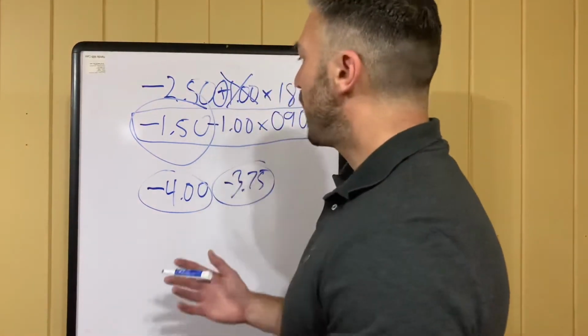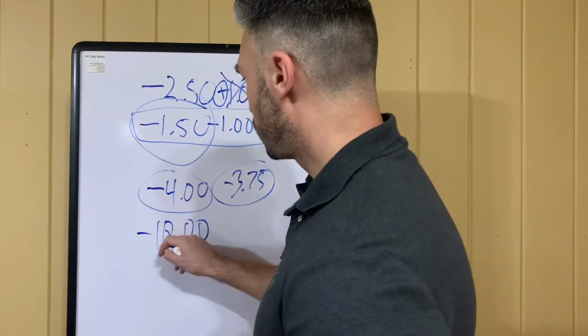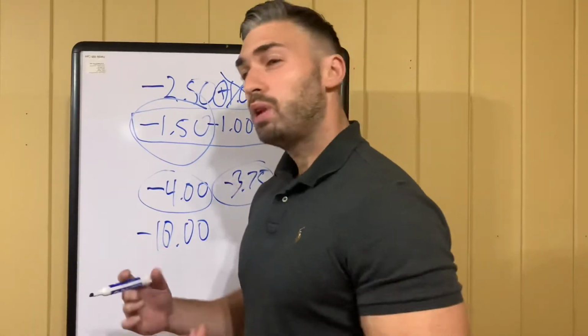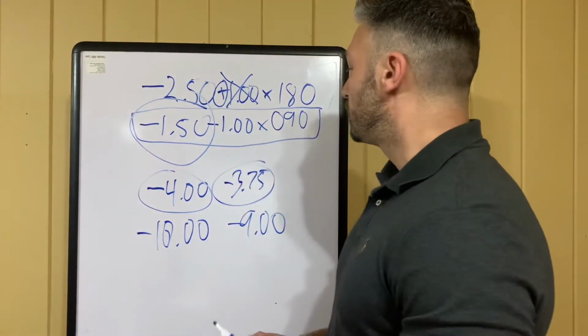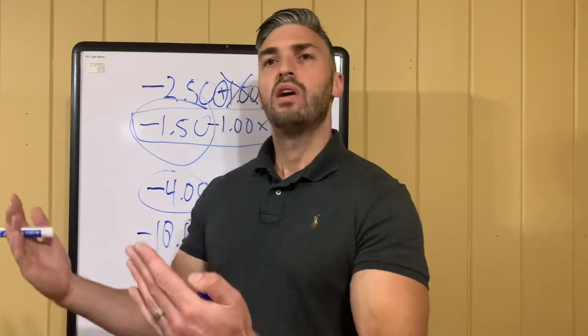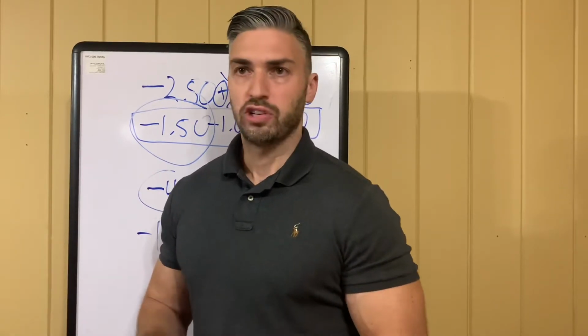And it's not exaggerated, so you could have a -10 prescription, and really when you compensate for vertex distance, making it more plus, it's really going to be only about a -9 or so. So never go with an exaggerated answer, but the important thing is to know that you're making it more plus when you're turning it into a contact lens prescription.